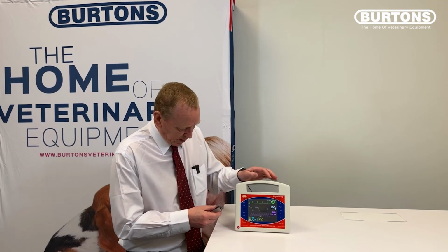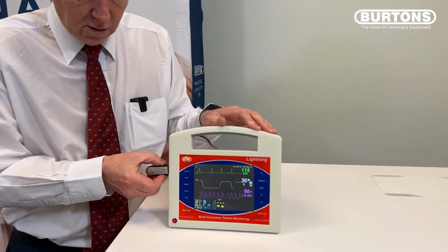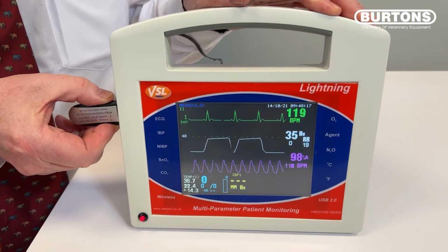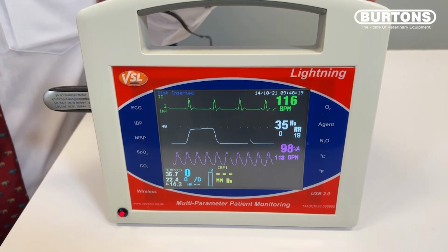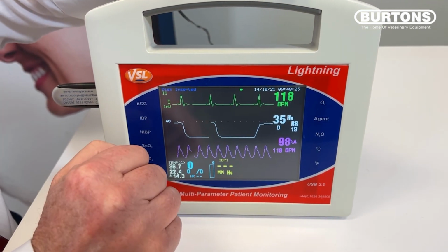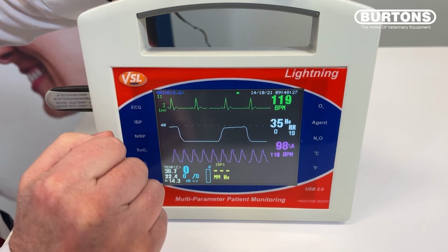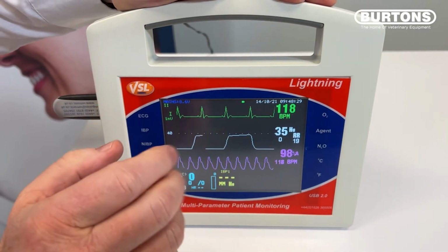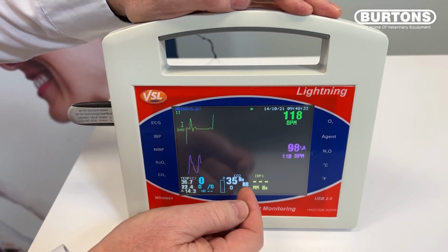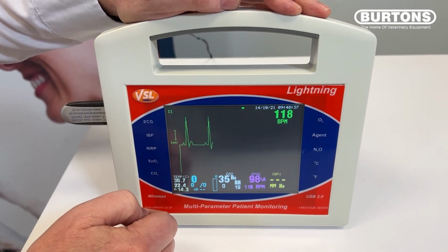All we need to do is to plug the USB stick into the USB socket on the side of the unit, and when you do, you'll hear a confirmation beep beep to say that the USB has been inserted. At the same time, a small flashing blue and yellow icon appears at the top to show that the ECG USB stick is inserted. Just to improve clarity, I'm going to remove this trace, and I'll remove the pulse ox trace so that we can just see the ECG there.